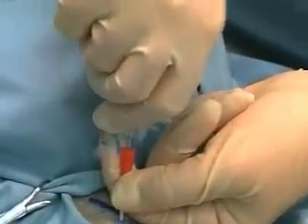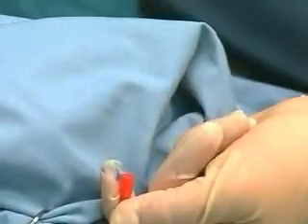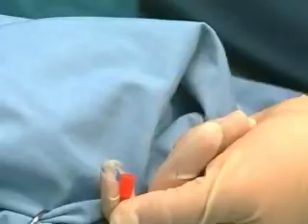Attach a 3 mm pediatric endotracheal tube adapter to the hub of the catheter. Attach a Y connector to the oxygen tubing and to the pediatric endotracheal tube adapter. Maintain oxygen flow at 15 liters per minute. Provide ventilation by intermittently placing the thumb over the open end of the Y connector for 1 second and off for 4 seconds.